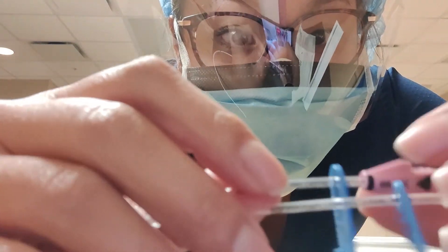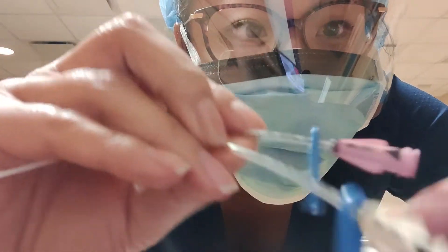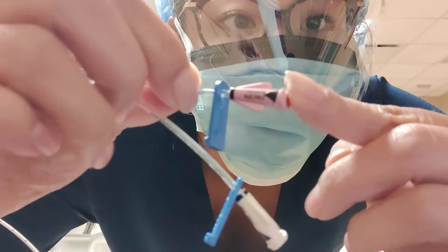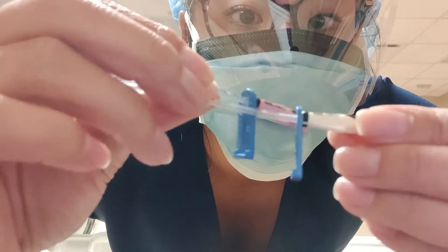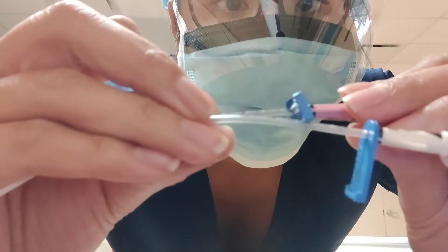I wanted to share that this PICC line has indications, so it's always great to read what you have. It says 'pressure injectable,' which means we can use this for CT. The flow rate is 4 milliliters per second. And then you have your distal and your proximal — the proximal is the white one and the distal is the pink one.